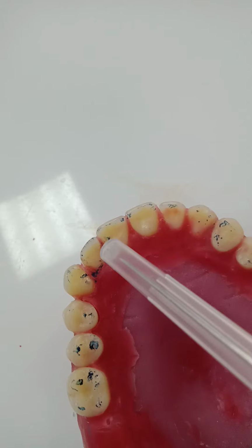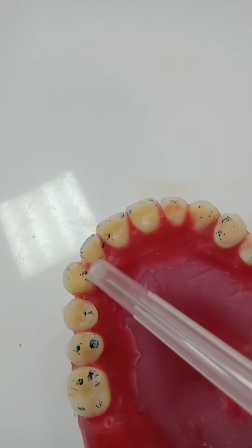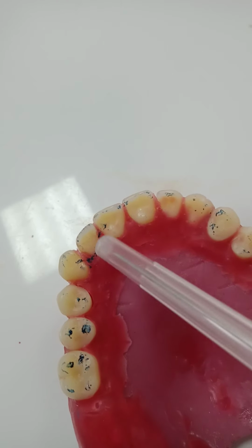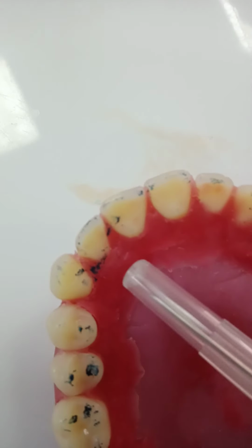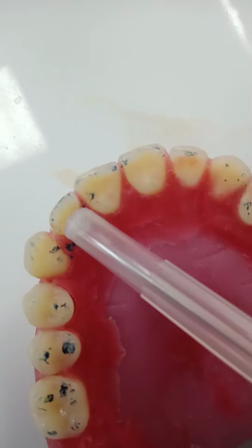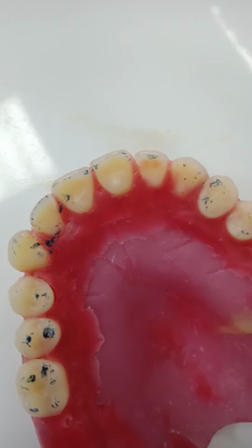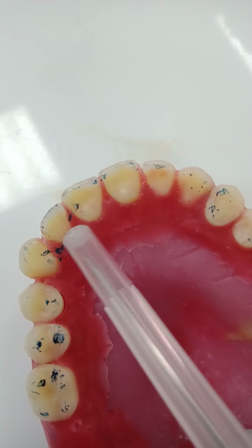So what our solutions are, I'm noticing where the heavy contacts on these teeth are. I find that the wax here is involved in the incisal guidance, so I'm going to reduce the wax here. I'm going to reduce the wax here, and I'm going to tilt maybe the gingival part of the lateral, tilt the tooth slightly more labially. So see this palatal part? I'm going to push it a bit more labially. So try to create something like this. By this, I'm avoiding the heavy incisal guidance that's causing the dislodgement of the tooth out of the wax.